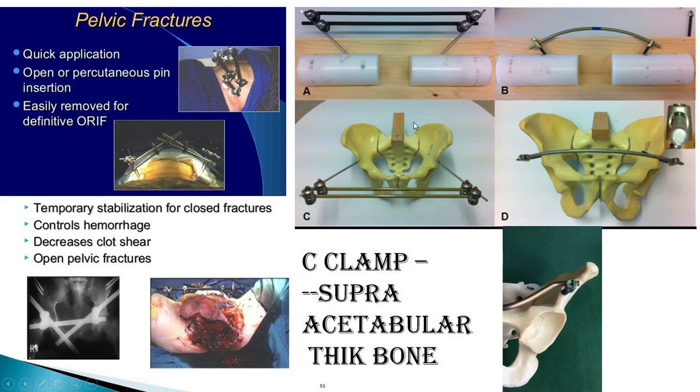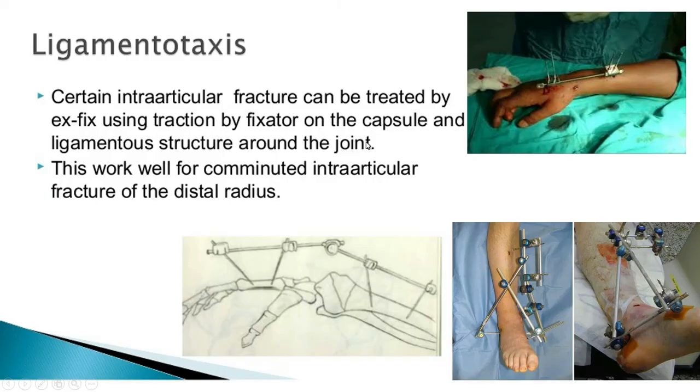You have to be assured about the blunt trauma, and you have to take care of the urological and genitourinary part, like you have to do any suprapubic catheter or any Foley catheter. And you should not do this operation alone. You have to take help of other fellows.